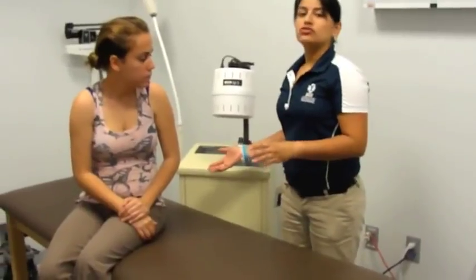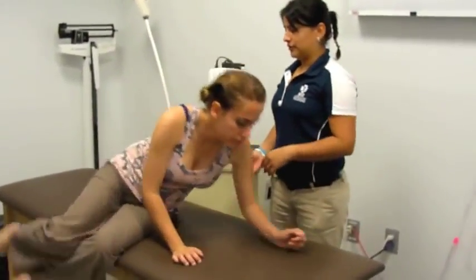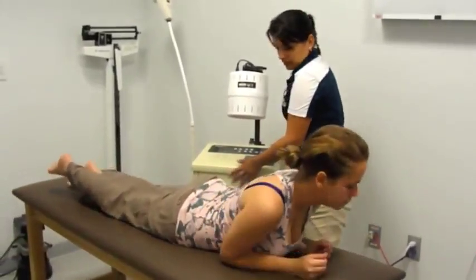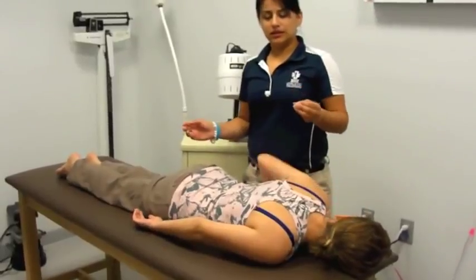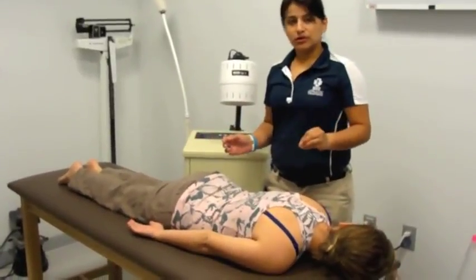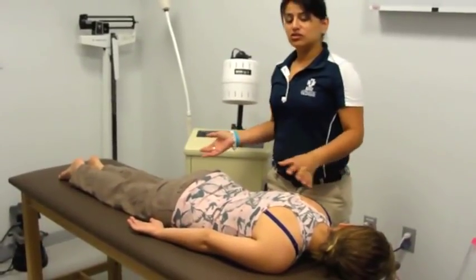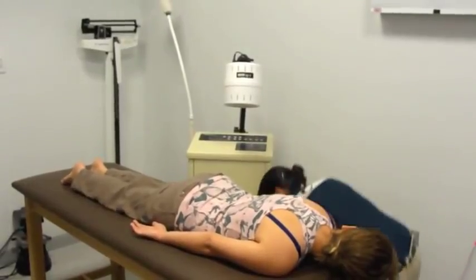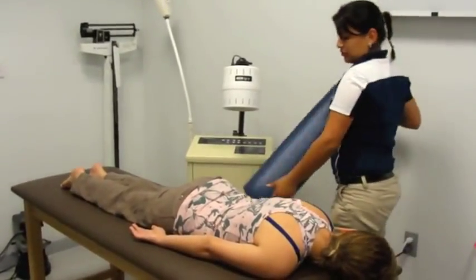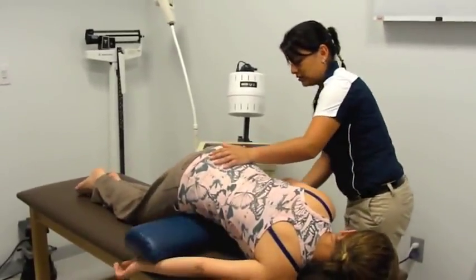For this treatment, we're going to use the low back. So go ahead and lay down on your stomach, with your head over here. Diathermy is not difficult to use, but the most important part is to set up the patient correctly, because the patient is going to remain in this position for the whole treatment. So to start off, we need to put the spine in a neutral position. Go ahead and lift your hips.